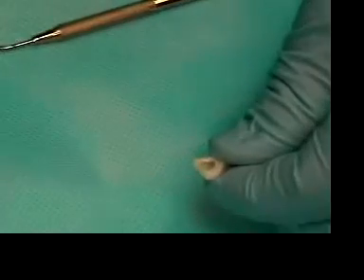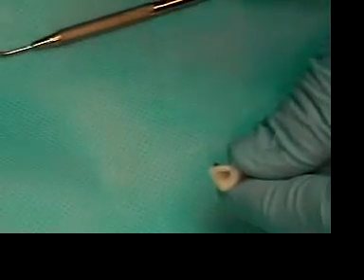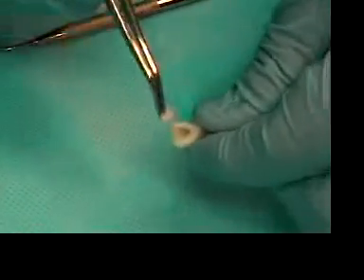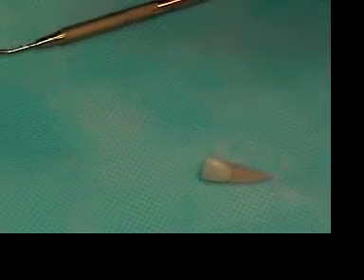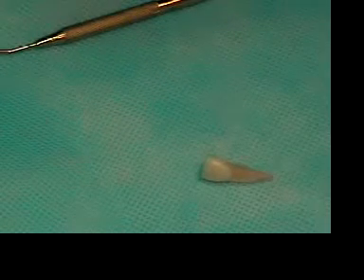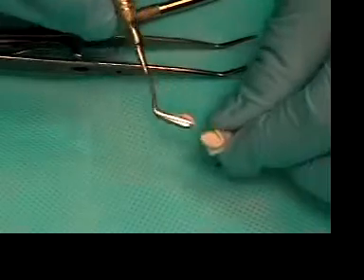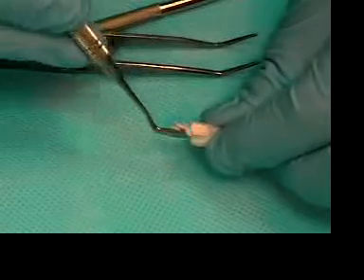Making sure that there's no bits of gutta percha or sealer left, and to temporize the tooth if we're temporizing. Clinically, we take a small cotton pellet and place it in the canal, then take some Cavit — basically a zinc oxide material that sets up with moisture.